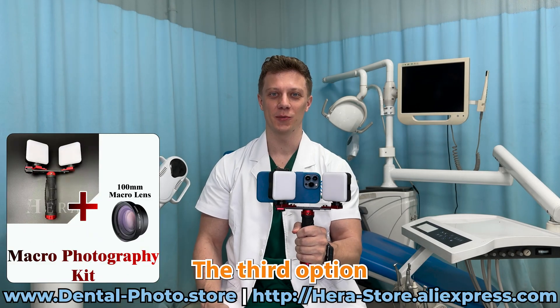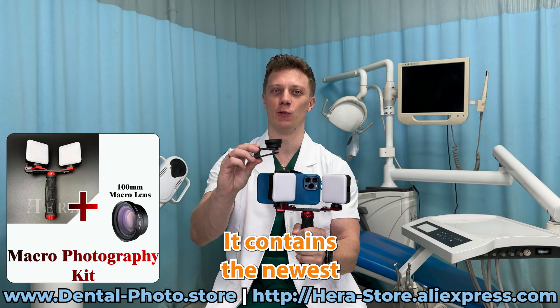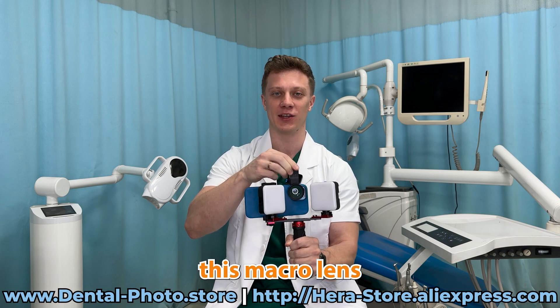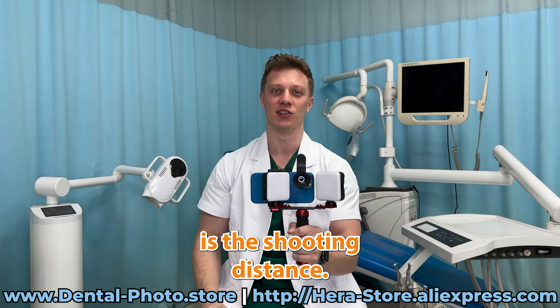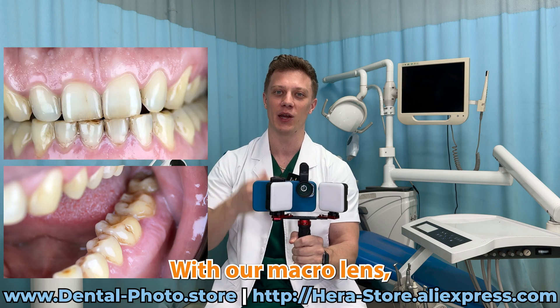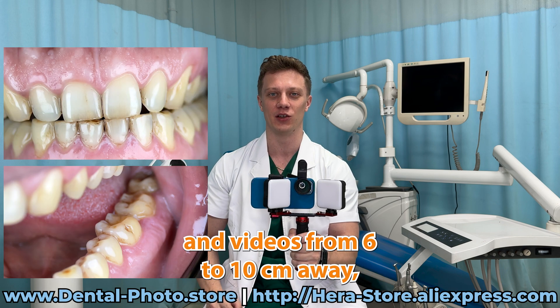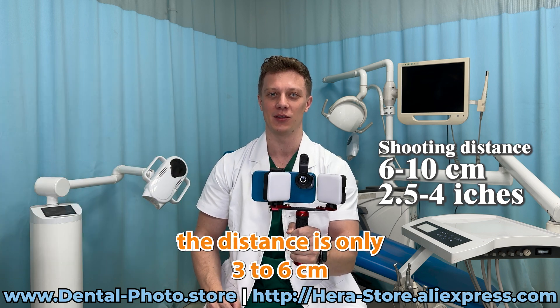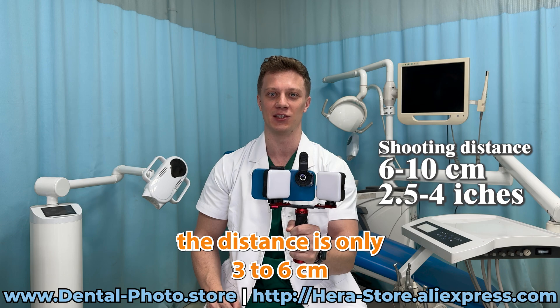The third option is the macro photography kit. It contains the newest 100mm macro lens. The difference between this macro lens and other macro lenses is the shooting distance. With our macro lens, you can shoot photos and videos from 6 to 10 centimeters away, while with other macro lenses the distance is only 3 to 6 centimeters.